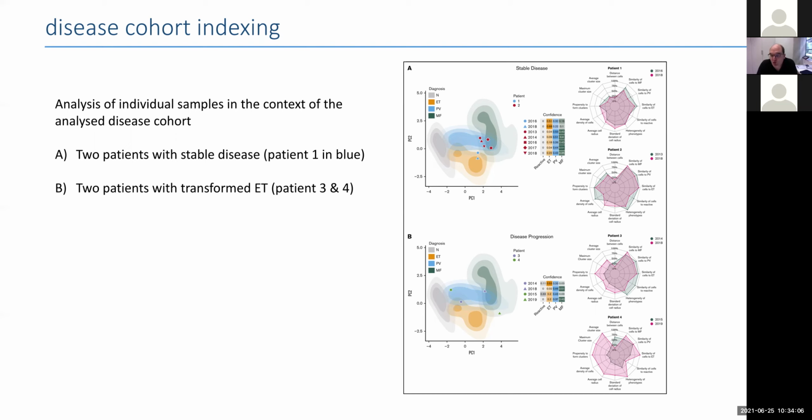So this shows that capturing morphological information in a more exact and robust way is extremely helpful in analyzing entire patient cohorts.